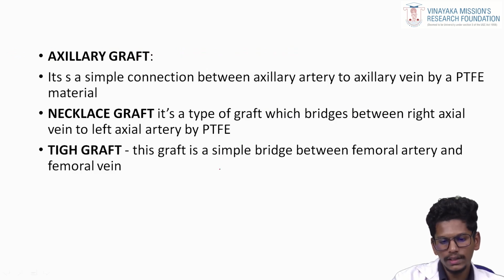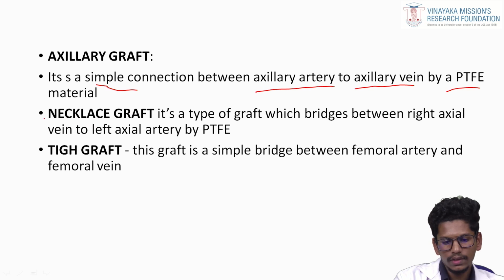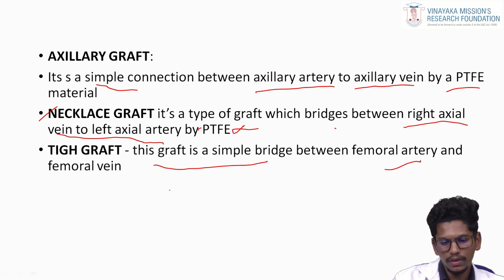Next we are going to see the axillary graft. An axillary graft is a simple connection between the axillary artery and the axillary vein by a PTFE material. Next is the necklace graft. It's a type of graft which bridges the right axillary vein to the left axillary artery by PTFE. Thigh graft. This graft is a simple bridge between a femoral artery and a femoral vein.